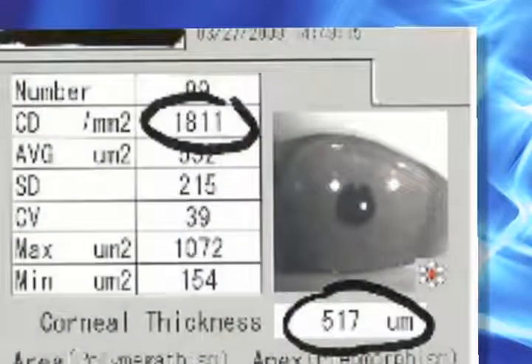If we don't know this ahead of time, cataract surgery can lead to swelling of the cornea, which then may require something called a corneal transplant operation or a newer operation called DSEK. If we have this test and I have the opportunity to determine just how healthy the person's cornea is, I can take certain steps to improve the safety of the surgery.